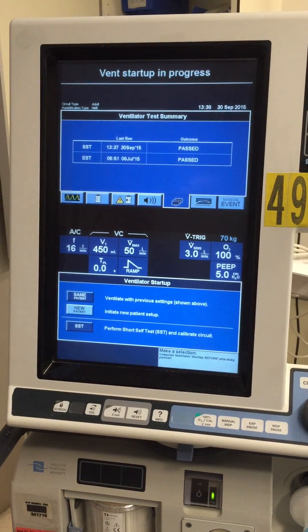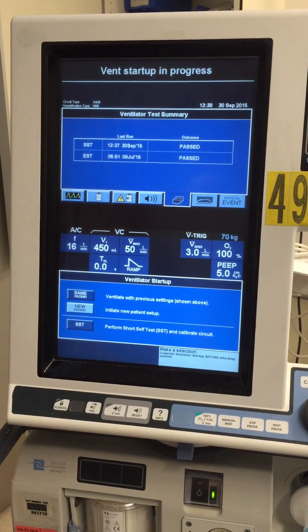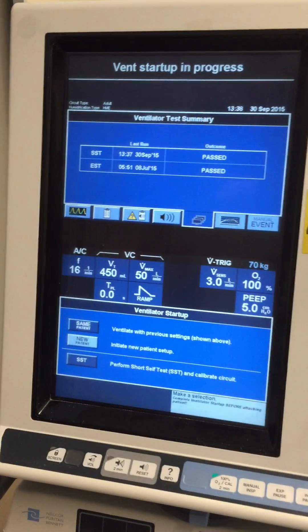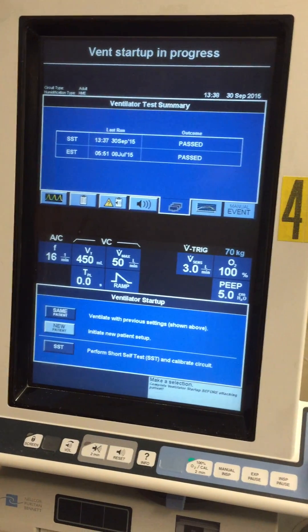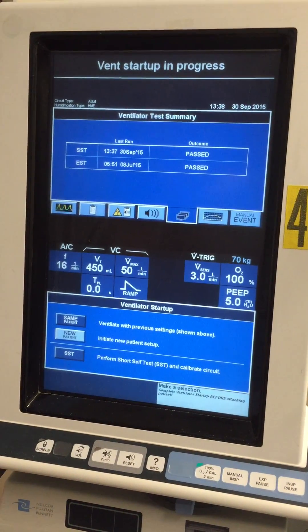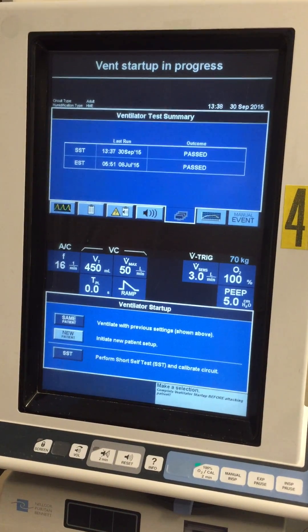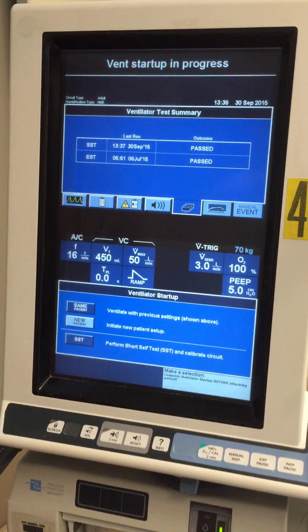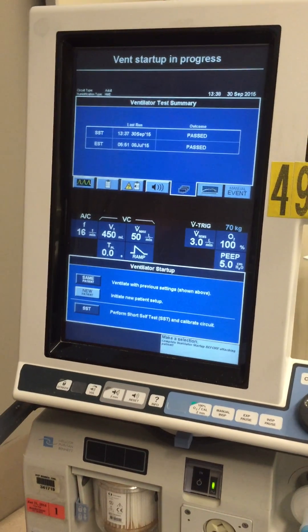Once you know it's safe to connect your patient to the ventilator after performing the short self-test, this is how you actually connect the patient to the ventilator.